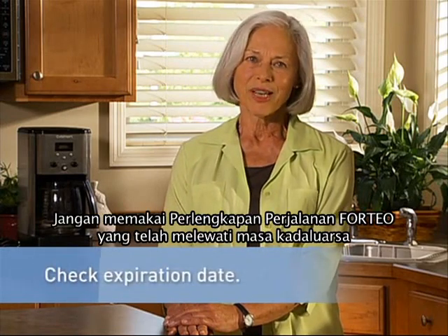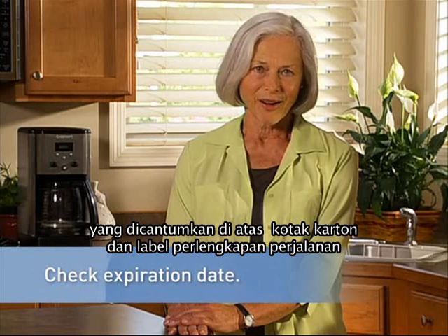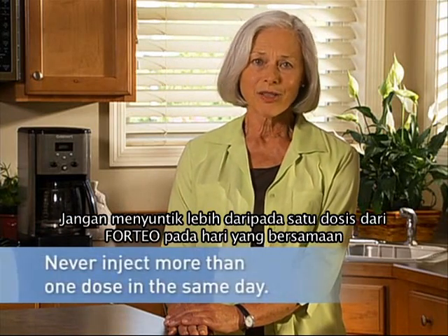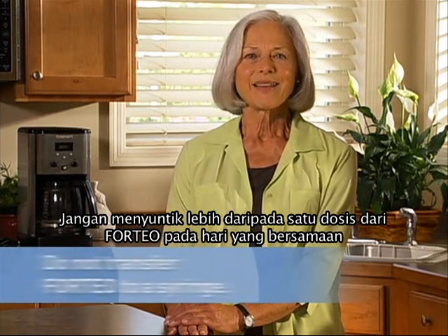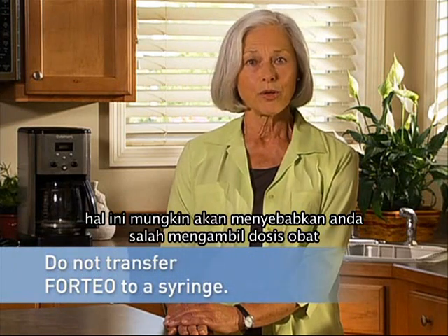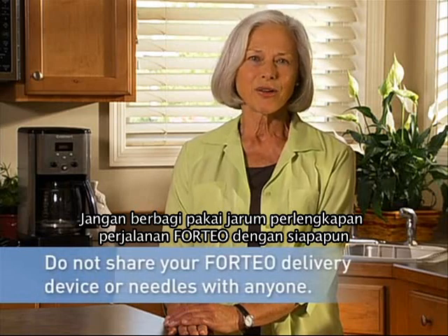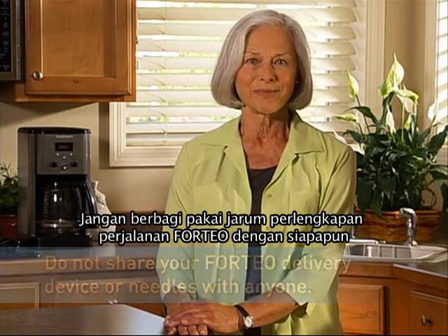Do not use the Forteo delivery device after the expiration date, printed on the carton and delivery device label. Do not inject more than one dose of Forteo in the same day. Do not transfer Forteo to a syringe. This may result in you taking the wrong dose of medicine. Do not share your Forteo delivery device or needles with anyone.